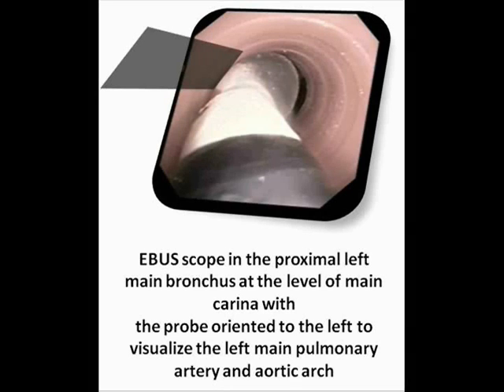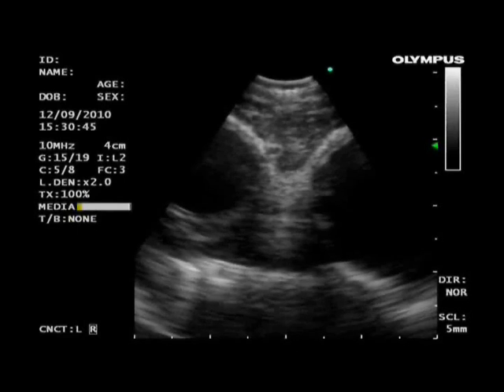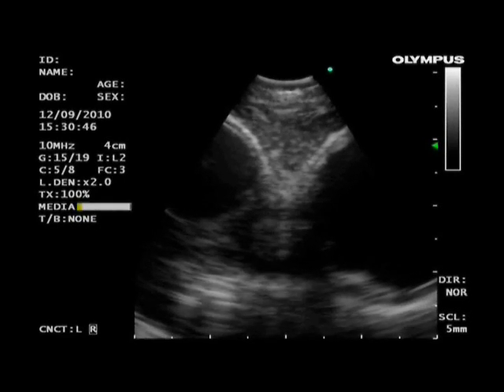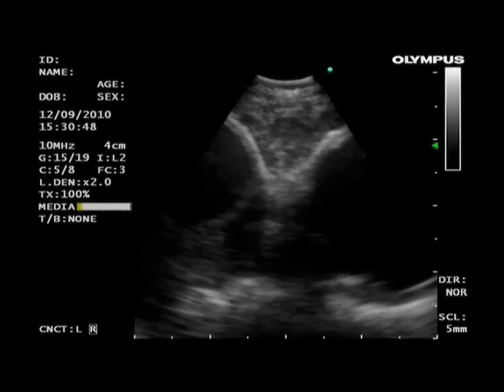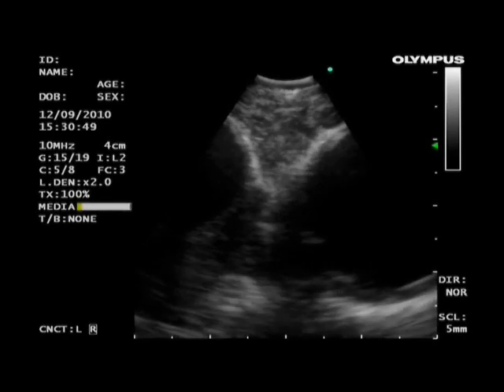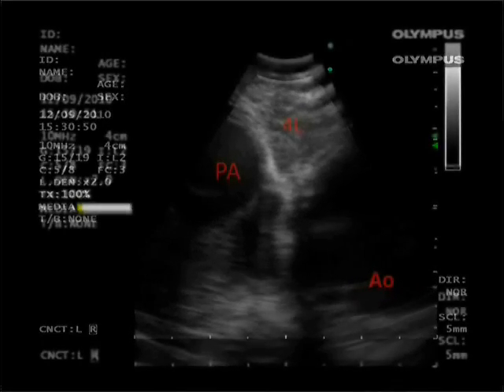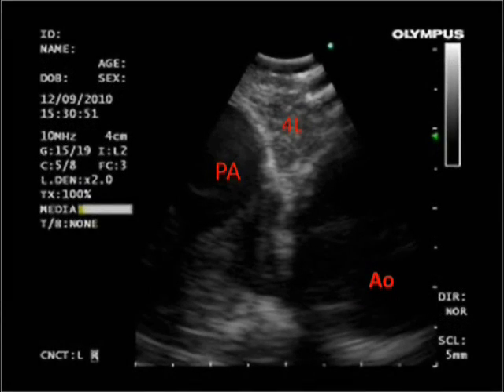As the scope is moved into the left main bronchus and oriented laterally, the left main pulmonary artery and aortic arch come into view. This video shows a 4L lymph node above the pulmonary artery and below the aortic arch.